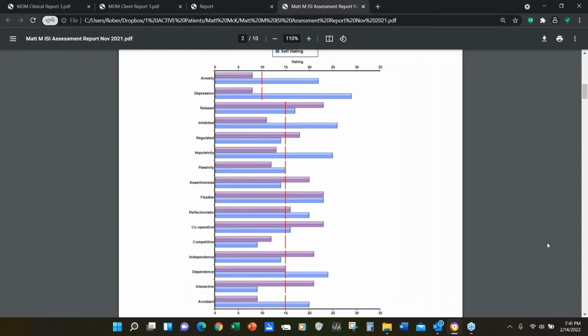Interesting. Well, you're an RN. That makes sense. Yeah. I always go over the ISI first with everybody. I think it's partly the bias of how you're trained. I was trained as a psychologist, so I tend to go over the ISI, and I go over it in detail with them before I show them the map, and that has worked well. I do too. I do that absolutely blow by blow, everything.